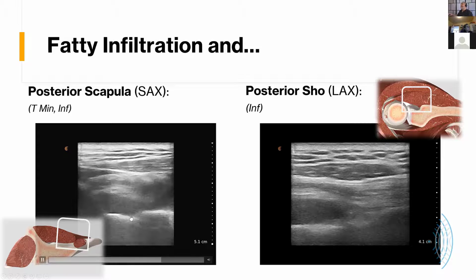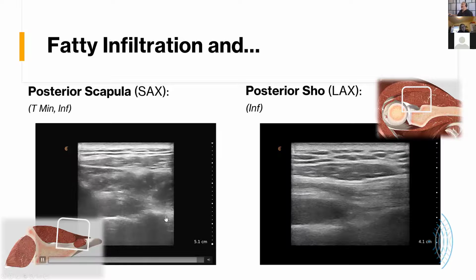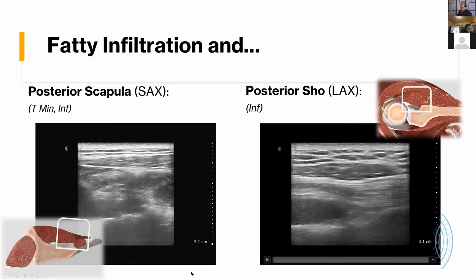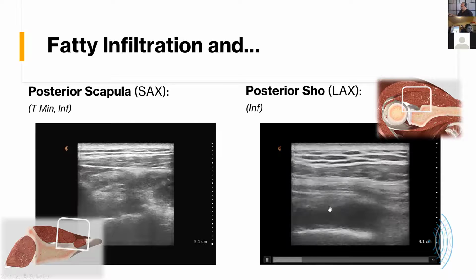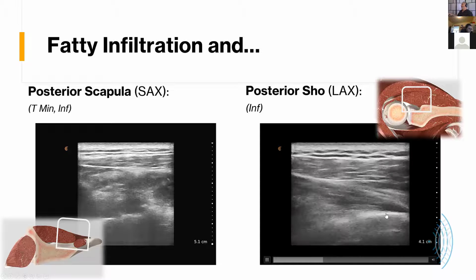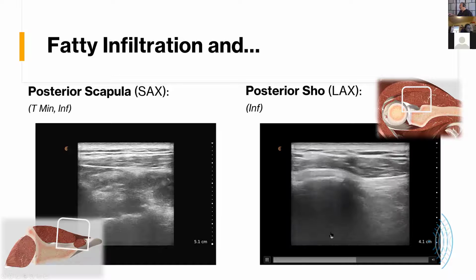look with me at the bottom of this. There should be no darkness between infraspinatus and the bone of the scapula. This darkness was interesting; it offended me in the picture because there should not be anything dark, especially this dark, between muscle tissue and the scapula. So I turned the probe 90 degrees. We call it orthogonal. This is long axis infraspinatus in the bottom right. And this is a very large paralabral cyst. And if you look close, that's fluid that's coming from the labrum.